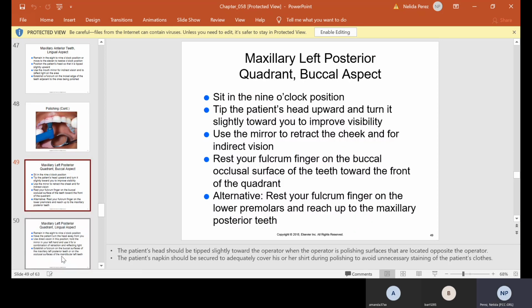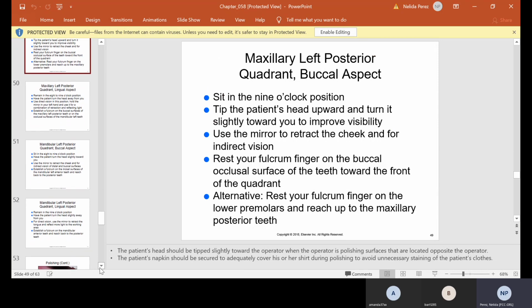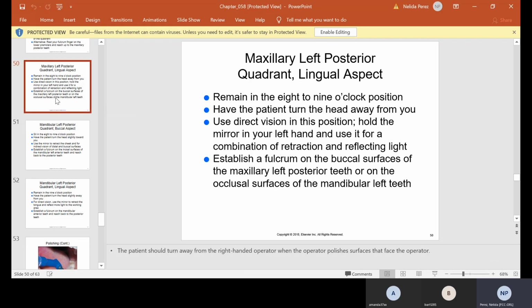So for the maxillary left posterior quadrant on the buccal, you're going to sit in the 9 o'clock position. You're going to tip the patient's head upward and turn it slightly toward you to improve visibility. Use the mirror again to retract the cheek and for indirect vision. You're going to rest the fulcrum finger on the buccal occlusal surface of the teeth toward the front of the quadrant. Alternative is to rest your fulcrum finger on the lower premolars and reach up to the maxillary posterior teeth. Honestly, once you get in the position of cleaning the teeth, you'll see what works best for you.